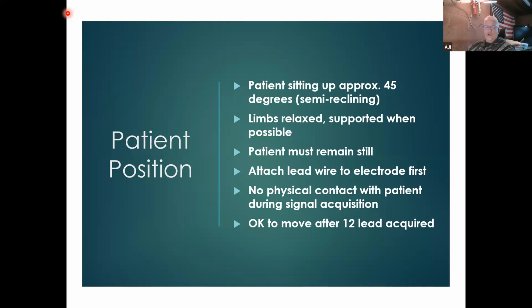You have to get a good initial baseline EKG before we do almost any other treatments, or any treatments at all. We should be getting this EKG. So if we're treating for nausea, we should do an EKG. If you're treating for chest pain and you're going to give nitroglycerin or assist with nitroglycerin, we should get an EKG first. We should get a set of vital signs. All of that type of stuff comes together. Don't think of an EKG as a treatment. Think of it as an assessment.